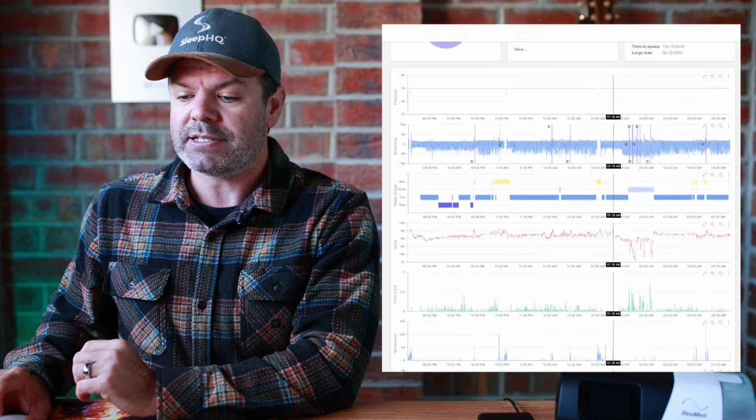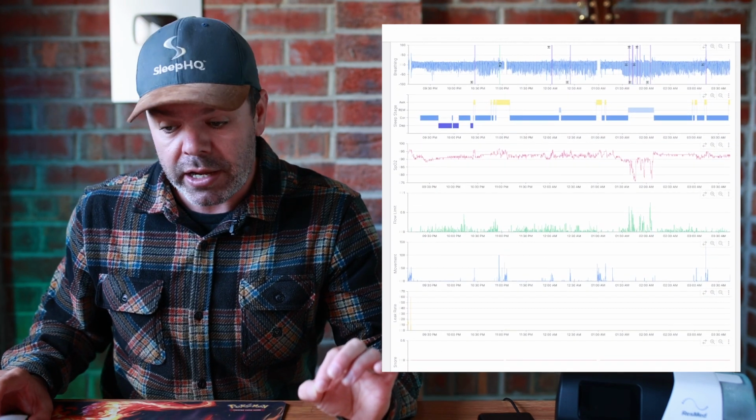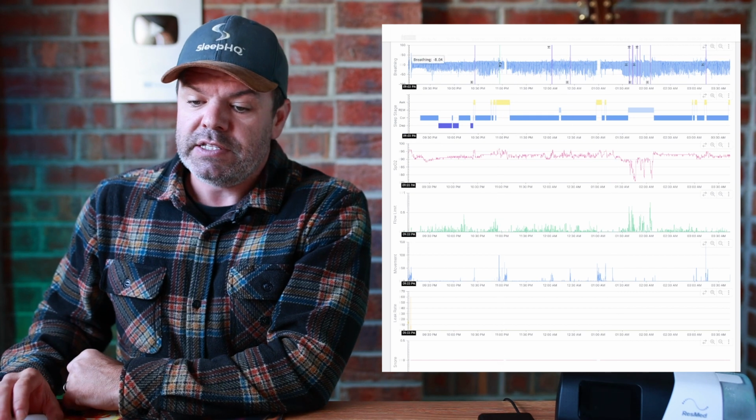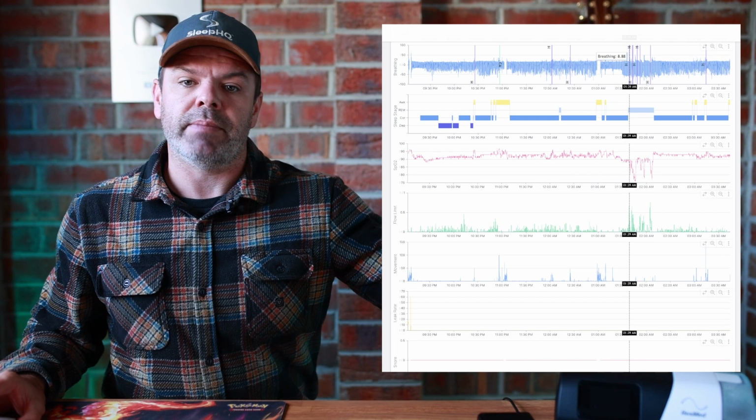Let's have a look at Jay's profile on SleepHQ here. Now, it might not be causing ResMed problems. That's maybe why they don't care. Hey, they don't give the patients any of this information anyway. And the clinicians, well, who cares if Bob went to bed 30 minutes earlier? I get that. We'll scroll down to the breathing trace, breath by breath analysis, every breath Jay takes in high definition. And this information, the breathing, I'll zoom in a moment, is coming from the CPAP machine.